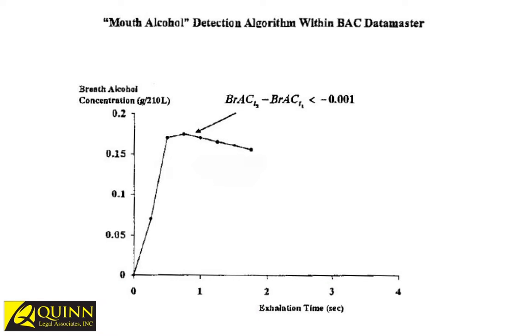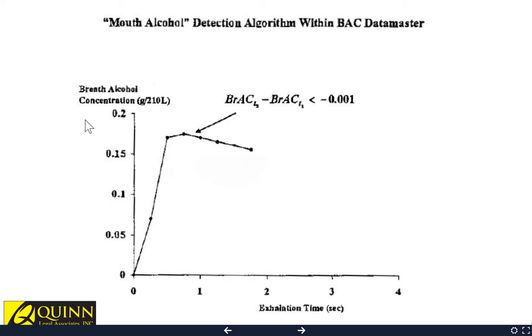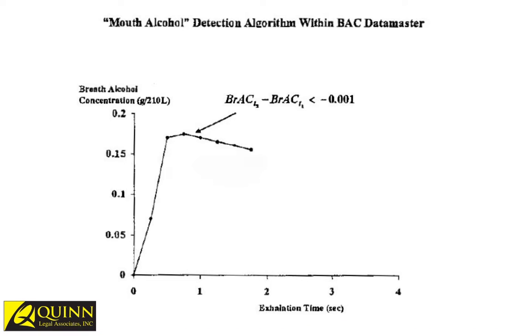So the reason behind this is because they have slope detection software in the machines. You can see here that when it's going to detect mouth alcohol, you'll see a drop and you'll have a negative going slope. Normally a good breath sample, you're going to see a rise, turn over, and slowly continue to rise on a pretty flat plane to the right. It's when you have this dip and you have a negative slope that the software of the machine will flag it as an invalid sample.